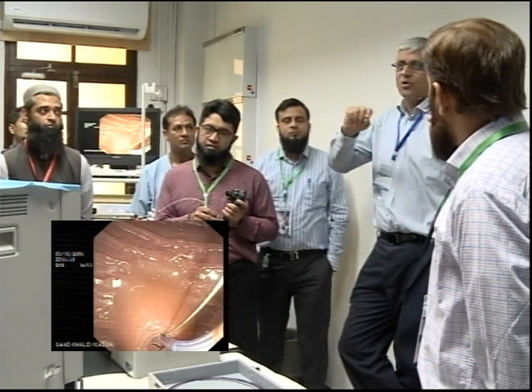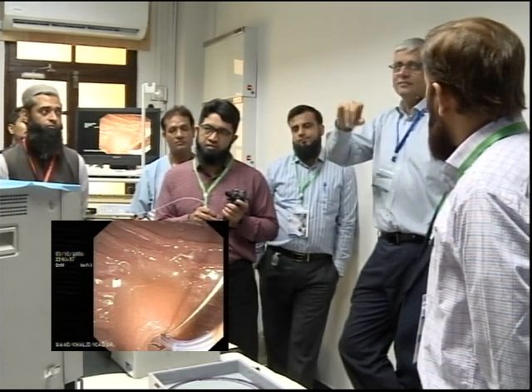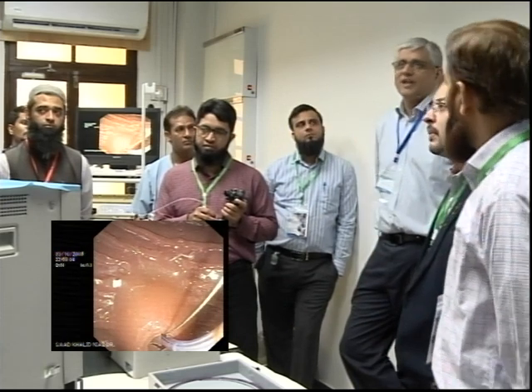My reports will now say first pass, second pass, third pass cannulation. So I write cannulation first pass, no pancreatic duct cannulation, we will not do anything. No, hum nahi, routinely nahi. Aap routinely dete?